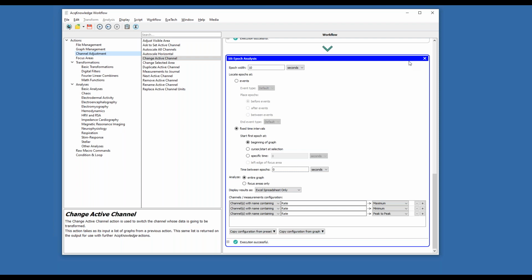You can keep going. What I'm going to do now is say, let's assume we want to perform some heart rate variability analysis over this ECG waveform, because this is a type of analysis that many of our customers like to perform. It's an important one, and this is a way in which you can automate two elements of the process. One is preparing the data before you actually perform the analysis, and then secondly, automating the running of the analysis.